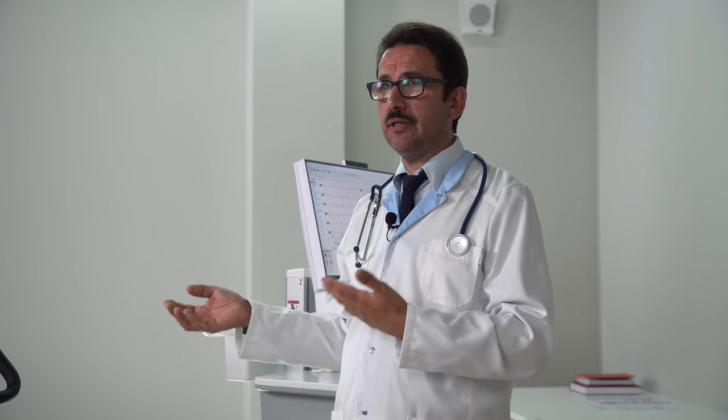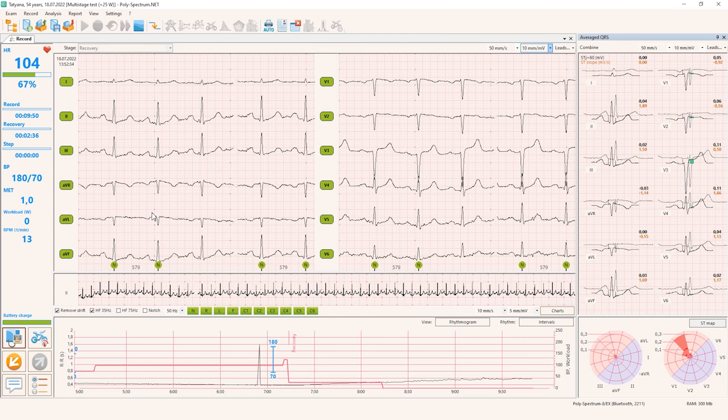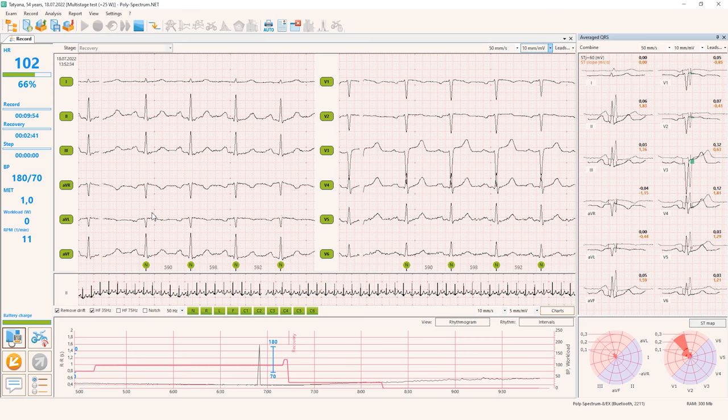Yes, if you achieved 85% and the patient doesn't have any complaints and you don't see ischemia signs on ECG, no ST segment depression or like this, you can say, okay, this test is negative. But for example, you see some signs of some small depression or something that looks suspicious. Why not move further and go to 90-95%? No problem if your patient allows you to do this, because there is no contraindication to continue the test according to the heart rate, actually. You need to think about different options, what you want to do with the patient, what result you want from the patient. I don't think that you want a questionable result in the end. You want some definite solution. Is it positive, negative, or, so positive or negative, there's no third option.